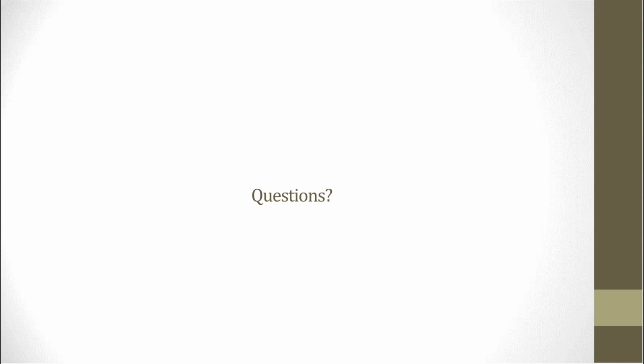All right, thank you. Next question. How long is a typical Oncomine Reporter report?